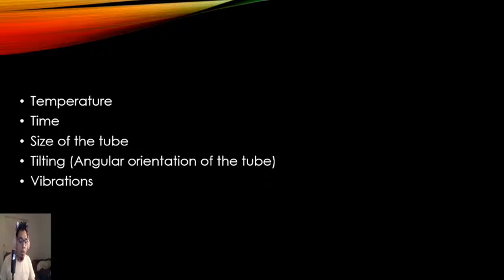The other questions were like this. The other choices were, for example, the tube that was used, could be the size of the tube. Which of the following has much more of an effect on the ESR? Actually, that was the correct way of asking the question. That was the one way that I remember the question was asked: which of the following can affect the results the most?